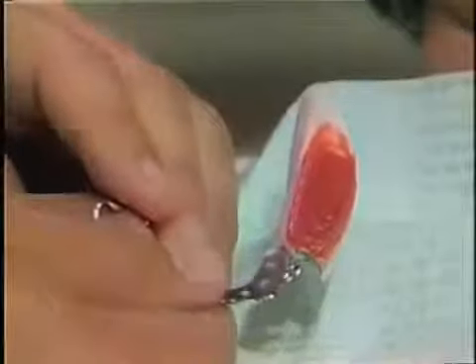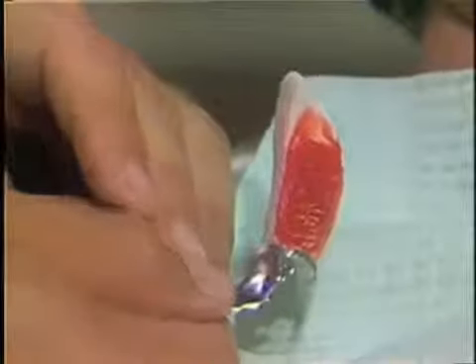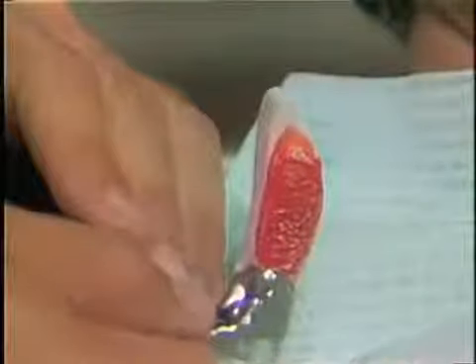The wax addition has been completed, and again we have added it to the occlusal table that has been created in the acrylic, and we've added it to a thickness of about 2 millimeters or so.